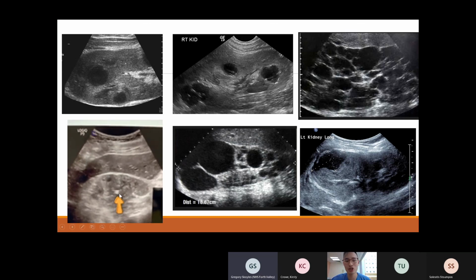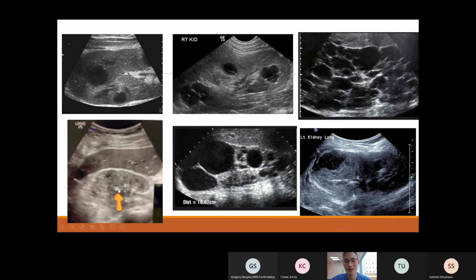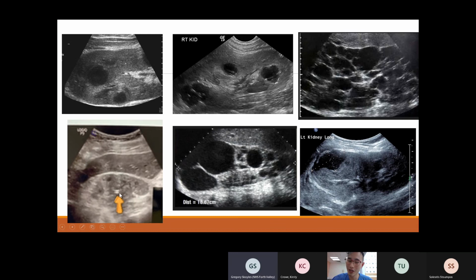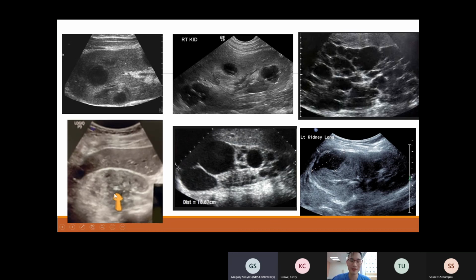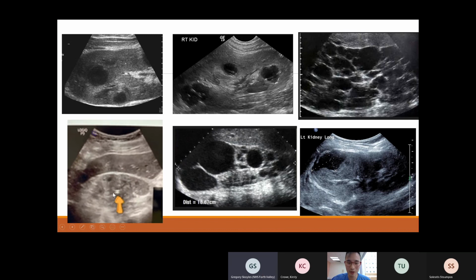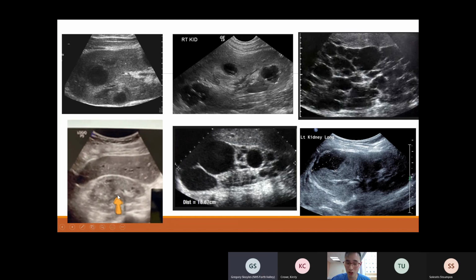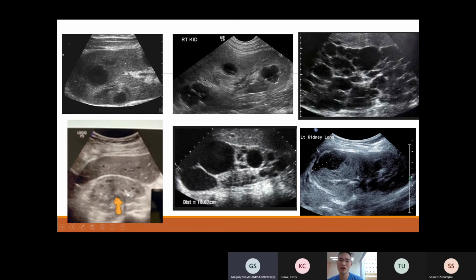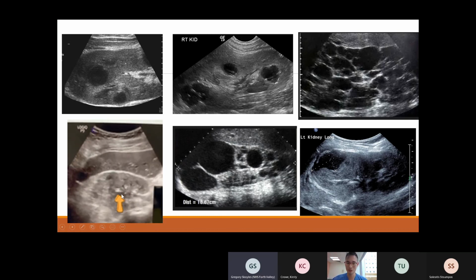What I'll tell you is that this looks tubular. Is that like a tubular cast, maybe? No, not quite. It's a tube that's going through. This is not your fault, this is because it's a bad image. So that'll be in a blood vessel, then, is what you're getting at. Not the blood vessel, it wouldn't be quite so big.